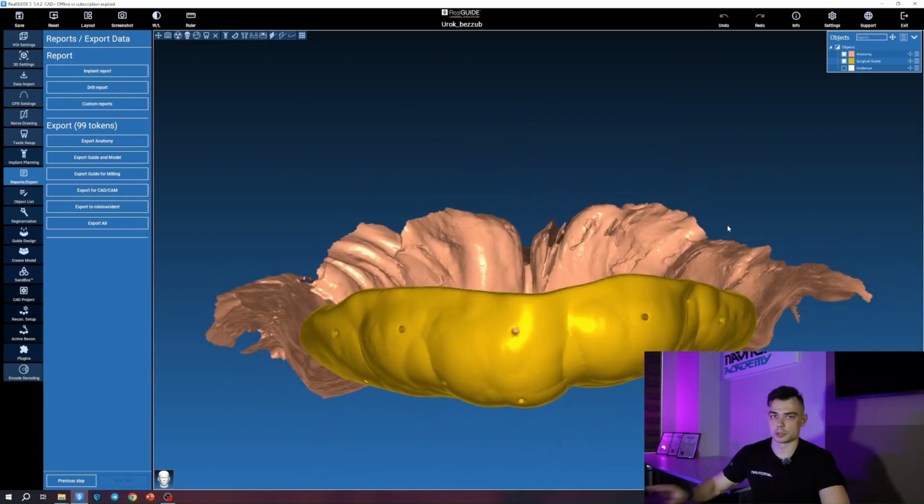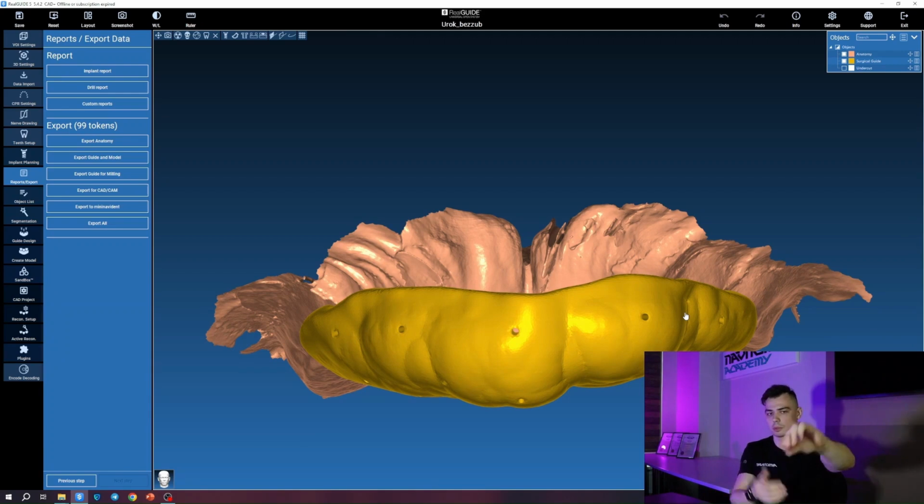If you're doing this for the first time, for example, it's better to invite the patient in. First, to understand for yourself how it works, and second, to explain to the patient how they should handle the template. And you fit this template in the oral cavity. You fit it, make sure it doesn't shift anywhere. If my fingers are the edentulous ridge, then it should look something like this.